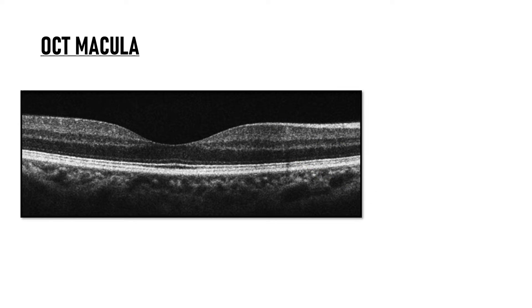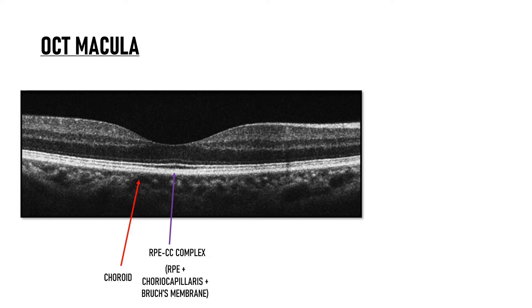Now let's identify the hyper-reflective layers as well. This is the choroid, and the hyper-reflective layer adjacent to the choroid is the RPE-CC complex, which is the outermost layer of retina. The RPE-CC complex consists of the RPE, choriocapillaris, and the Bruch's membrane. Internal to that is the photoreceptor layer, namely the inner segment-outer segment junction of photoreceptors. If you look closely, many different bands or zones can also be seen here, which we will learn about in detail a little later.